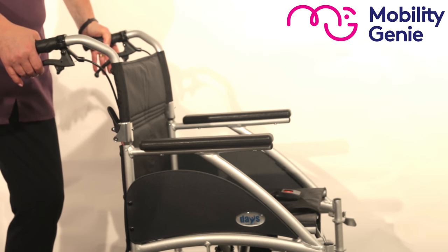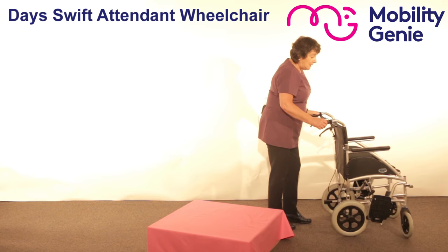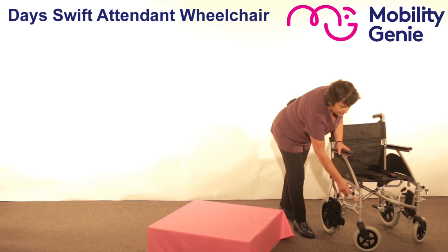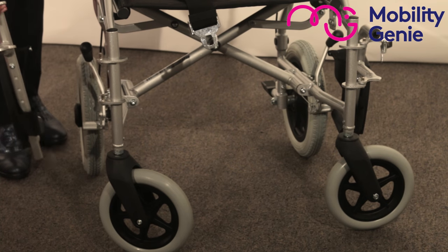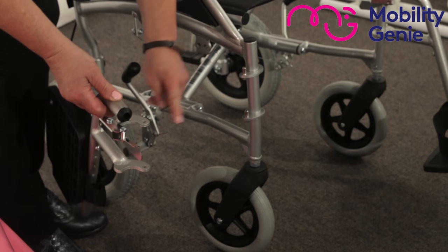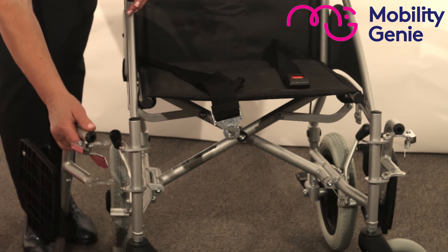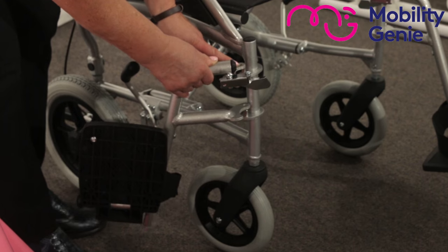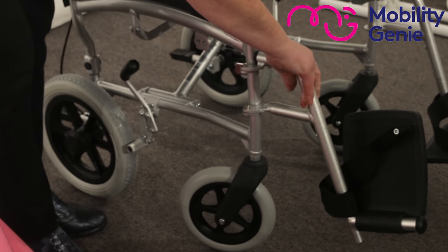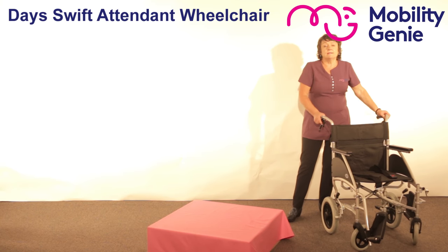To unlock the brakes, all you do is pull it up and let it go. Now I'm going to show you how to remove the footrest from the wheelchair — you just take it off like so. On the frame of the chair you've got two buttons, and on the footrest you've got two holes. You align the holes onto the buttons, slip them down over and lock it into place. So that's the Days Swift attendant wheelchair.